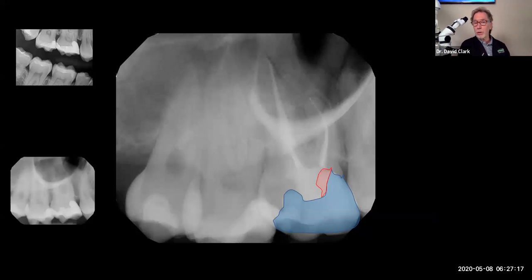And if we want to do a webinar in the future about more overlay cases and treating endodontically treated teeth with injection overmolding, let's do it. Whatever student that was, that was a perfect question, because now you're thinking ahead. Hey, David, how do you restore this? So yes, we injection overmold. This was 3 layers. I had to put bulk fill flowable down here. I did 1 more layer here. And then once I had about a 4 millimeter shell of injecting, I injection molded the rest.